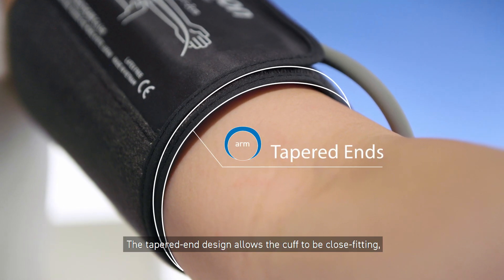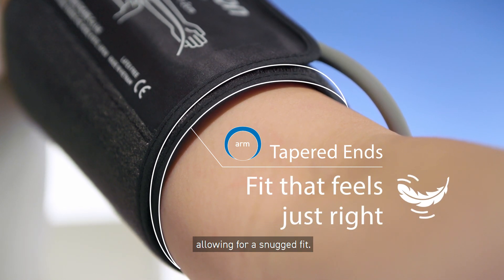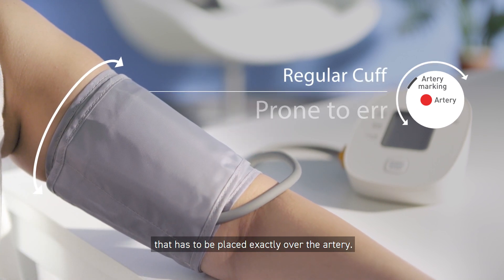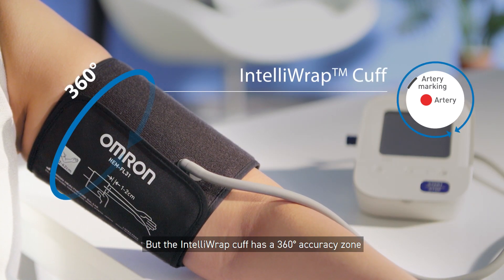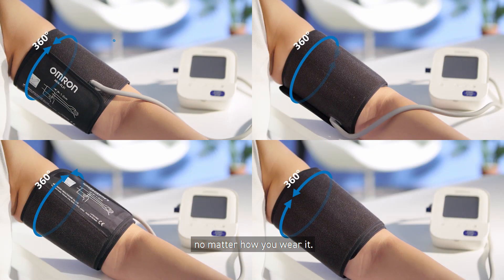The tapered end design allows the cuff to be close-fitting, allowing for a snug fit. A regular cuff has a limited accuracy zone that has to be placed exactly over the artery, but the IntelliWrap cuff has a 360 degrees accuracy zone that ensures an accurate reading, no matter how you wear it.